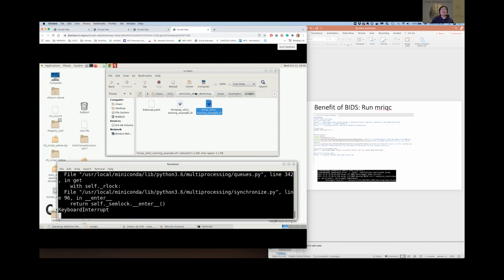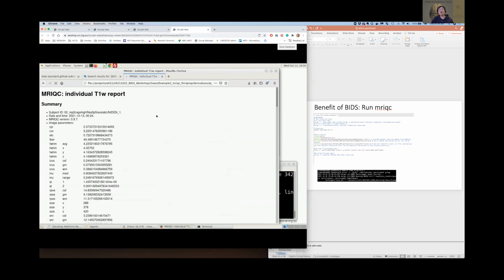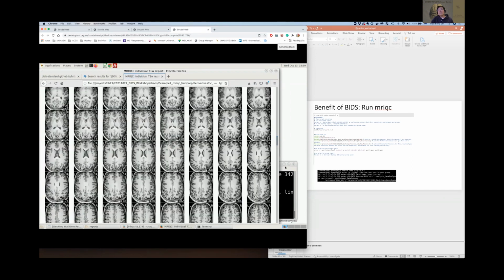Yes, exactly. Thanks. Because of the time, I'll just quickly show you what the output looks like for MRIQC. The derivatives were run before in the QC group, and here in the script, T1. So you have this beautiful report, because I only have n equal to 2, and then you will see all of these parameters on here. And you hover your mouse on it. This is the picture of subject 2, subject 1. You'll find it identical. Yes, I just duplicated the first one as the second one. You can tell. Yes, so that's everything. You click on it, it will navigate you to the individual reports, and those are the beautiful pictures that you want to get.